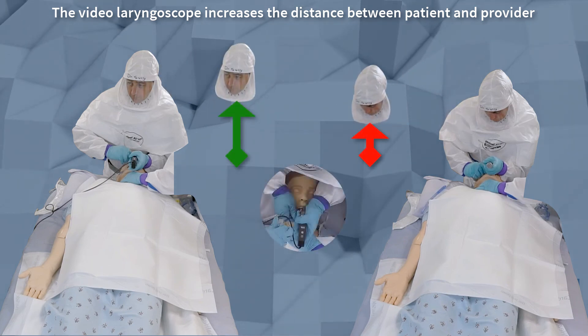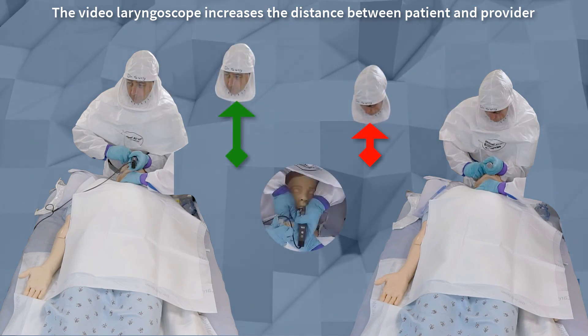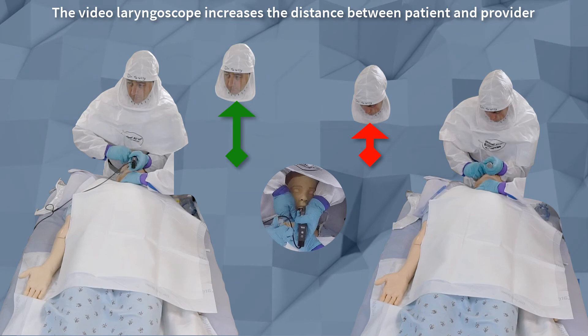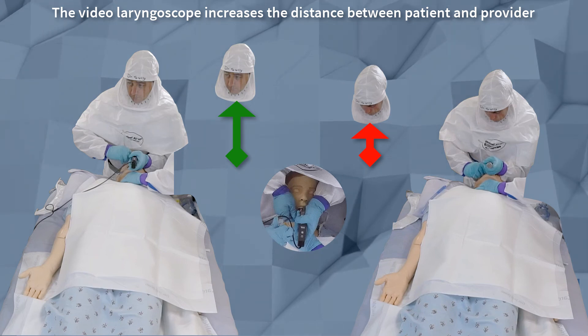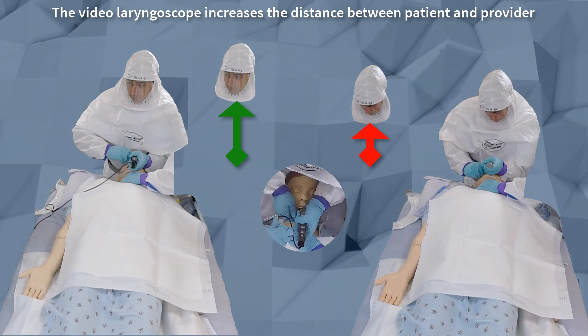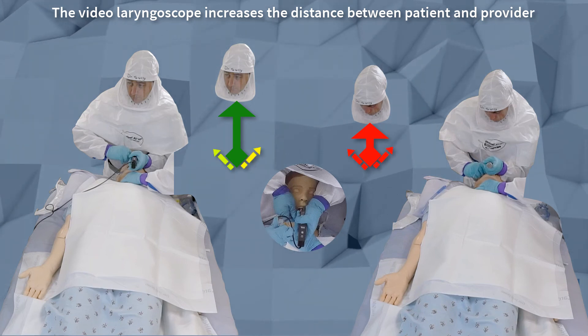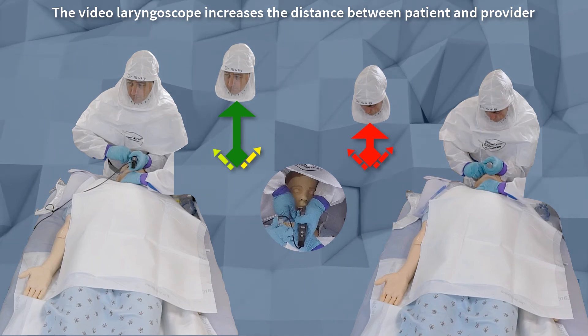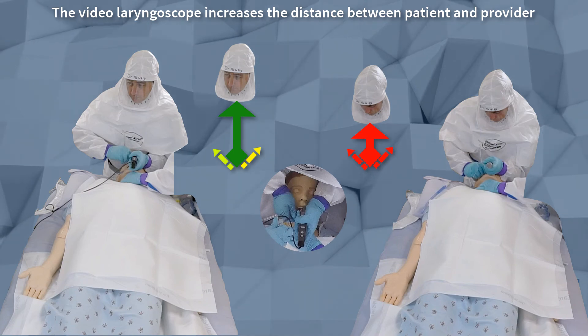Using a video laryngoscope as opposed to a traditional laryngoscope allows the provider to position their body further away from the patient, increasing the distance between the provider and the patient's airway.